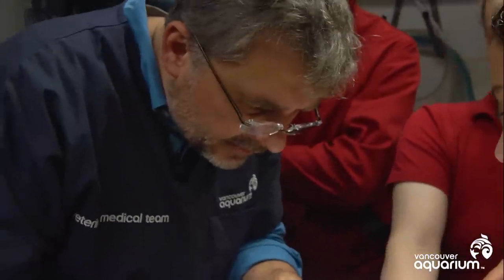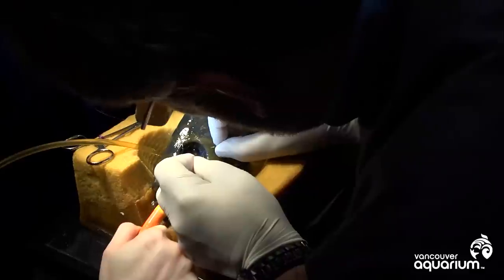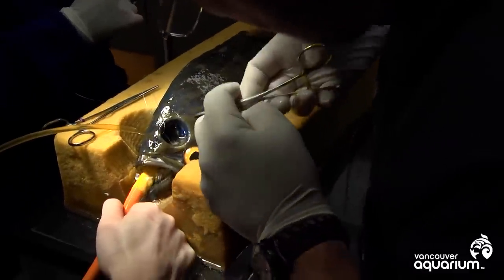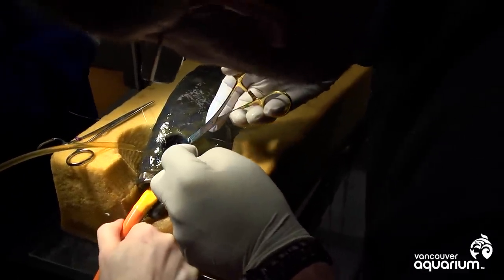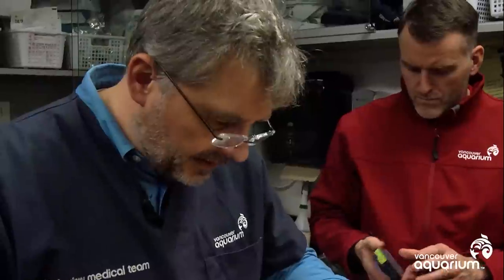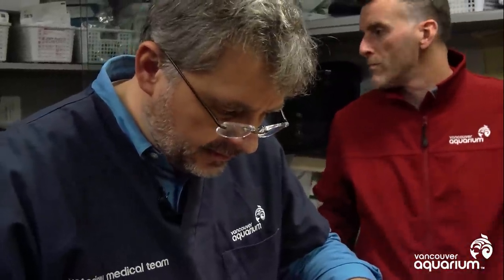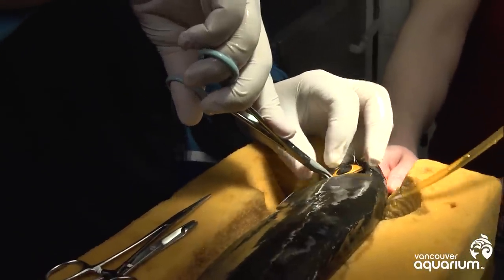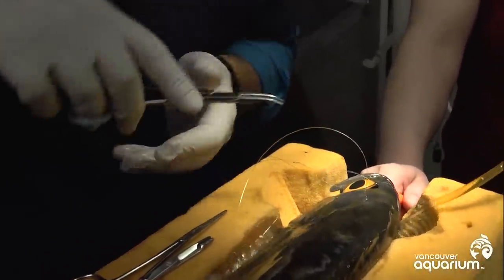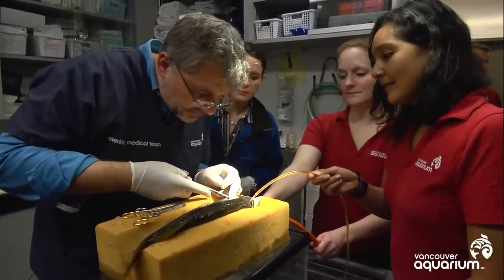Nice job. So I just use the needle to make a hole through the bone, and then I try to run the suture through the same hole. I'm going to have to move him up a little bit, just on his side. We're just cutting the suture, getting rid of the little tags.